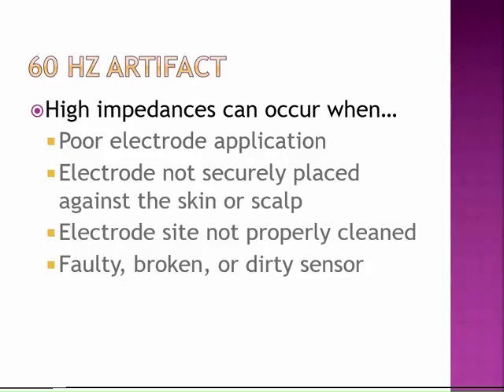You guys, when you're in the lab and practicing and you've already re-scrubbed the electrode site, you feel like you've done a pretty good job of it, the next step would be to try re-scrubbing the actual electrode itself, because if they weren't cleaned properly, if they weren't all physically scrubbed out with the toothbrush, they can come through and cause some poor signals.